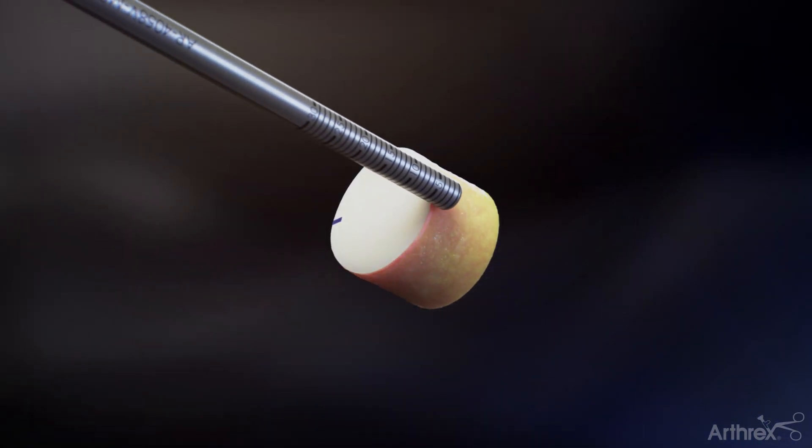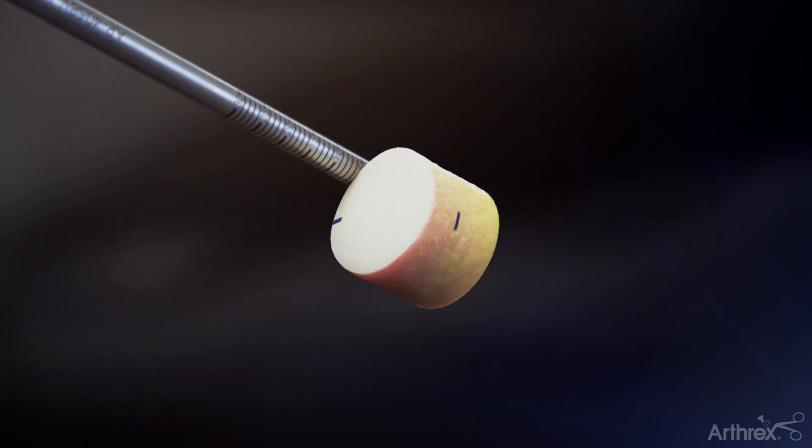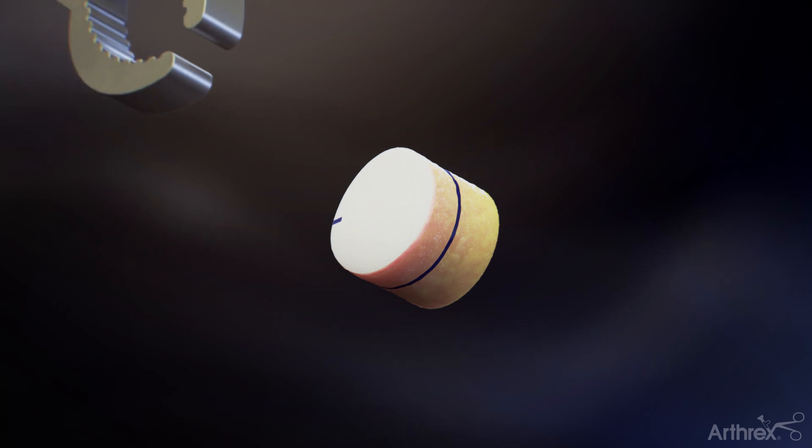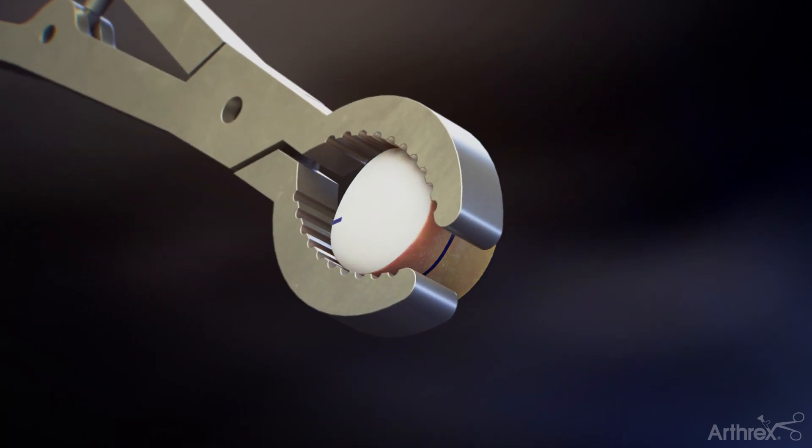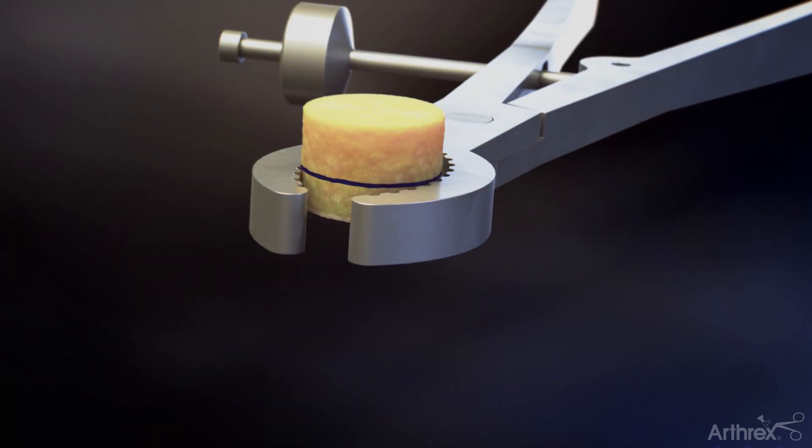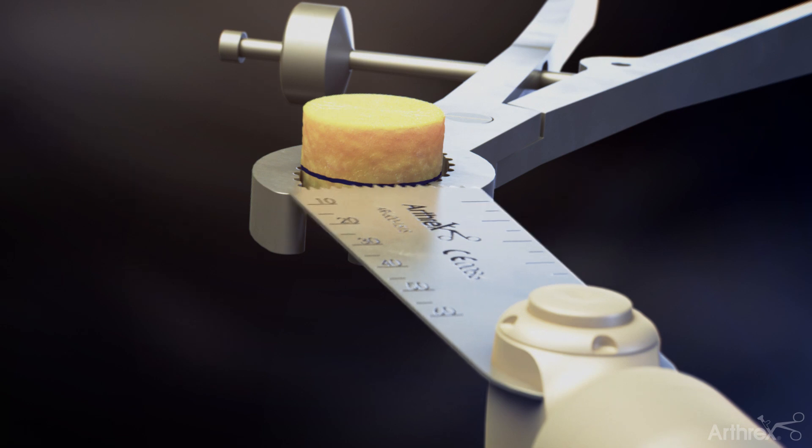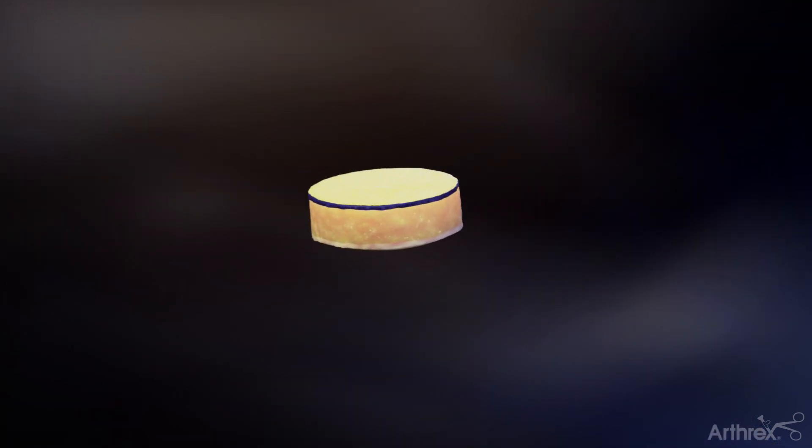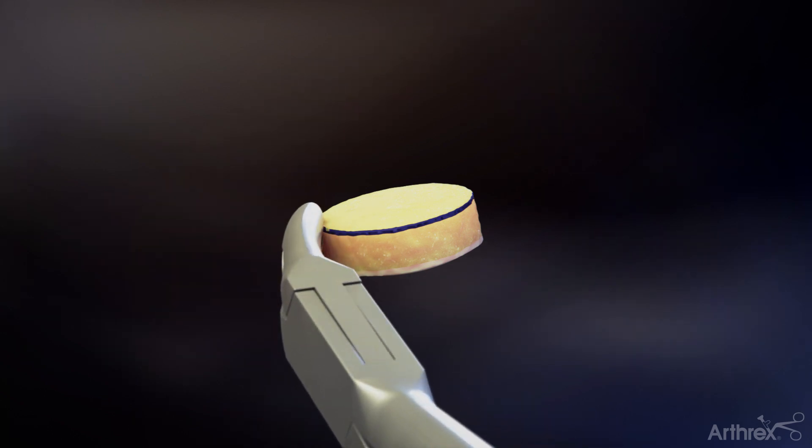Mark the depths recorded from the recipient socket on the four quadrants of the graft. Then draw a circumferential mark on the bone. Secure the graft in the allograft OATS holding forceps and use a saw to slowly trim it to achieve the appropriate length of bone to ensure a press fit in the recipient socket. Bulletize the graft with a rongeur to assist with insertion.